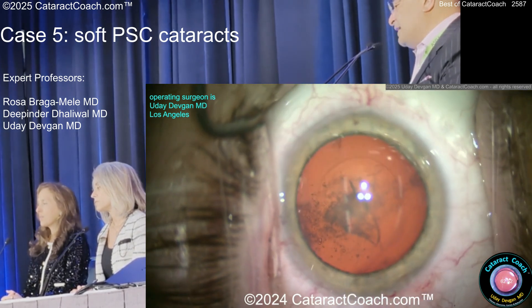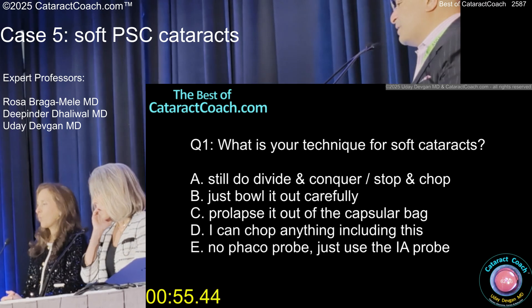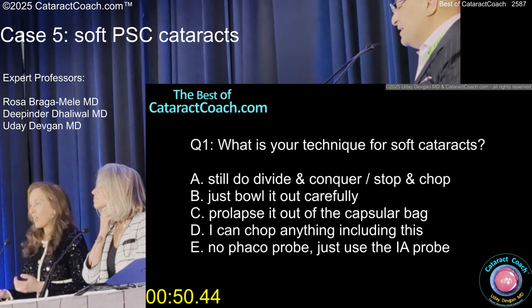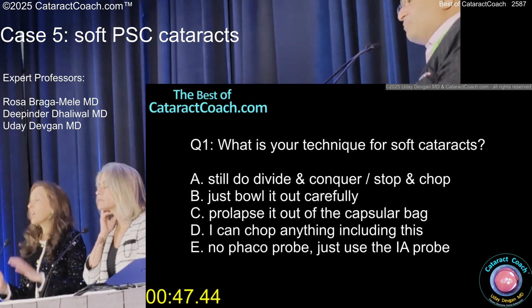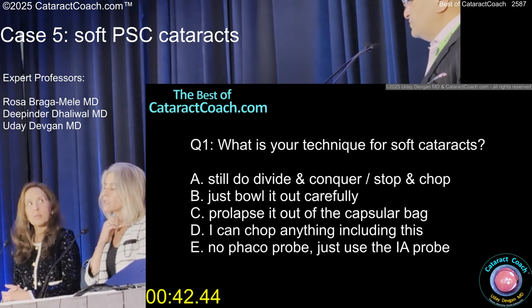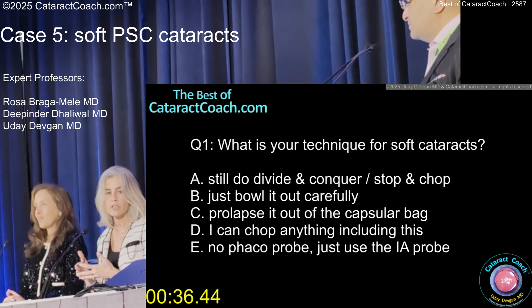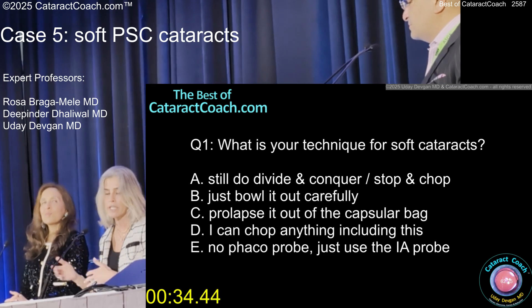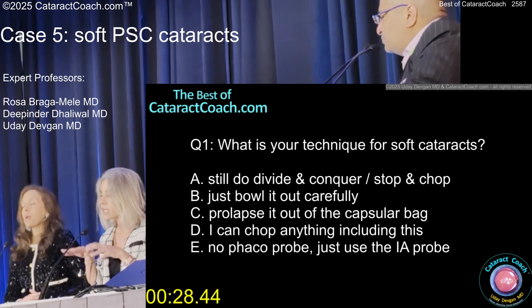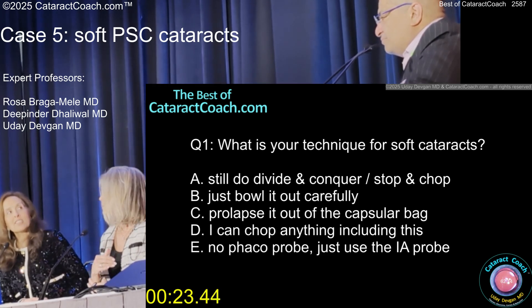It wasn't that terrible, so I got a nice rhexis done. What do you want to do? I'm going to get this thing out of the bag. Do you still want to do your best stop and chop? I do. Because I hate prolapsing stuff on the bag. But what if it's super soft? I do hydrodissection, hydrodelineation, get that nucleus out, and then just take the epi-nucleus. If you have any concerns about zonular issues, do not prolapse it out of the bag. Chop in the bag and keep all the pieces in, maintaining zonular stability, until you've done all your maneuvers, then start removing pieces. The epi-nucleus is going to stabilize it.